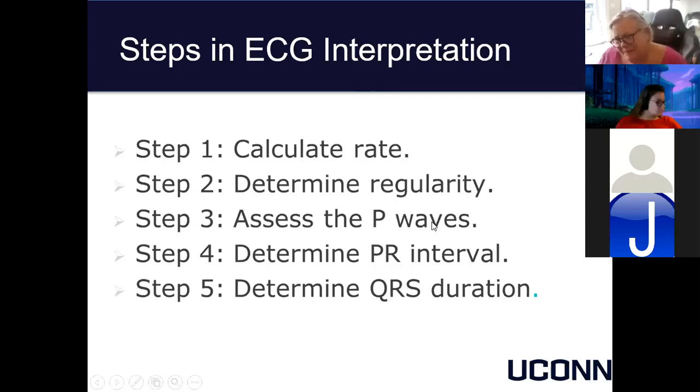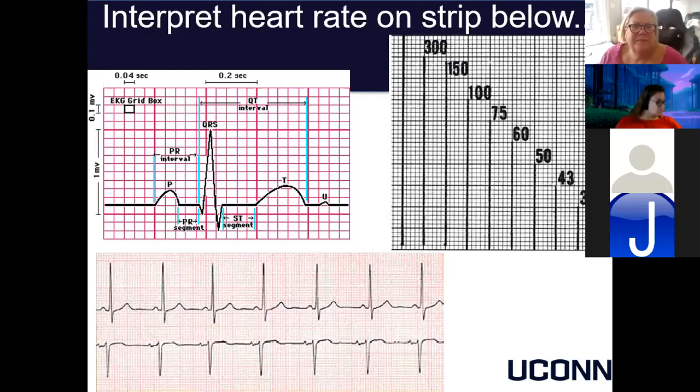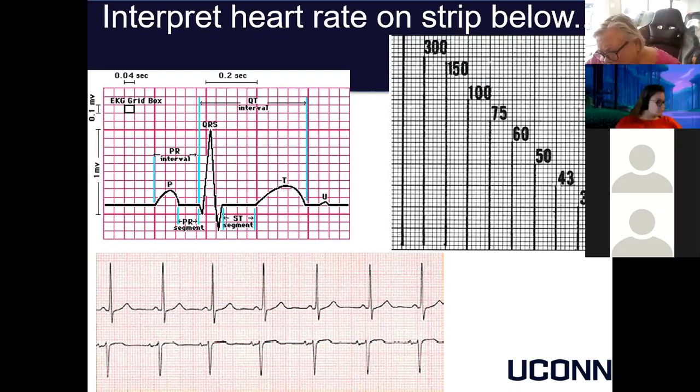I just sort of want you to get some experience. When in the field, when you do an EKG, isn't there most of the time a box in the corner that essentially tells you all those values that we just saw? Like PR interval, heart rate, QRS duration, QT interval. Yes, nowadays there are. It wasn't always like that. And you will still see your cardiologists sitting down with calipers and measuring this stuff out.